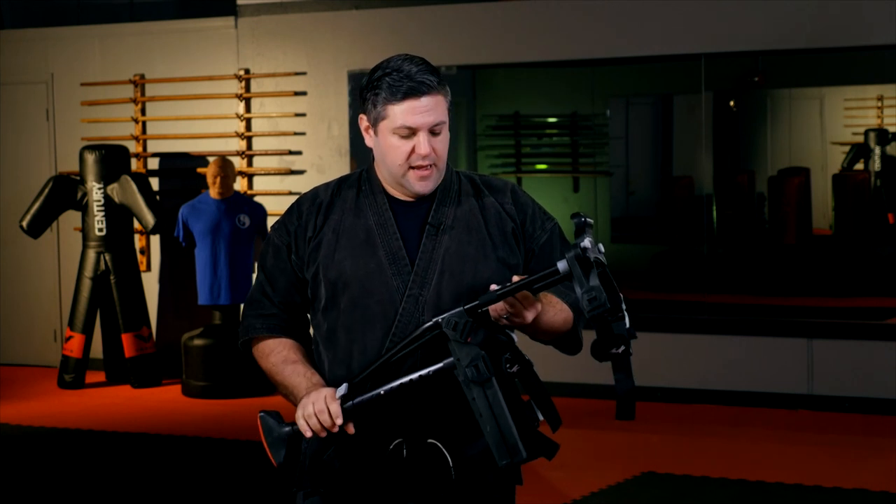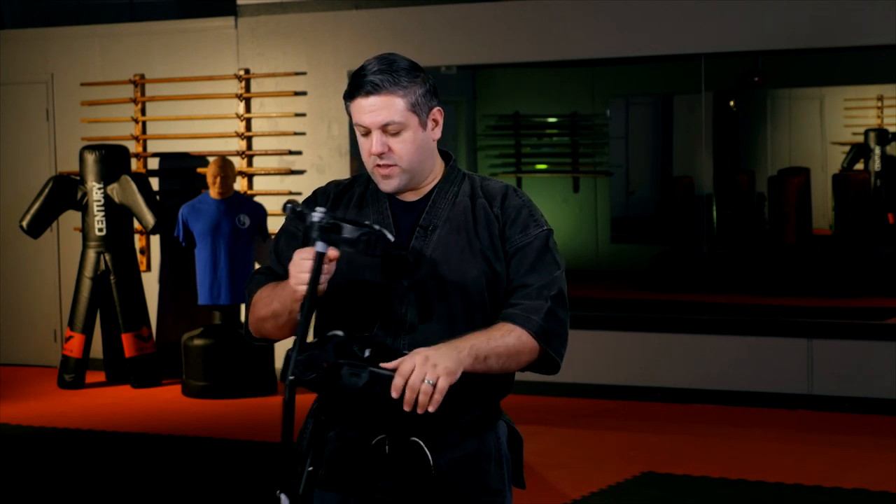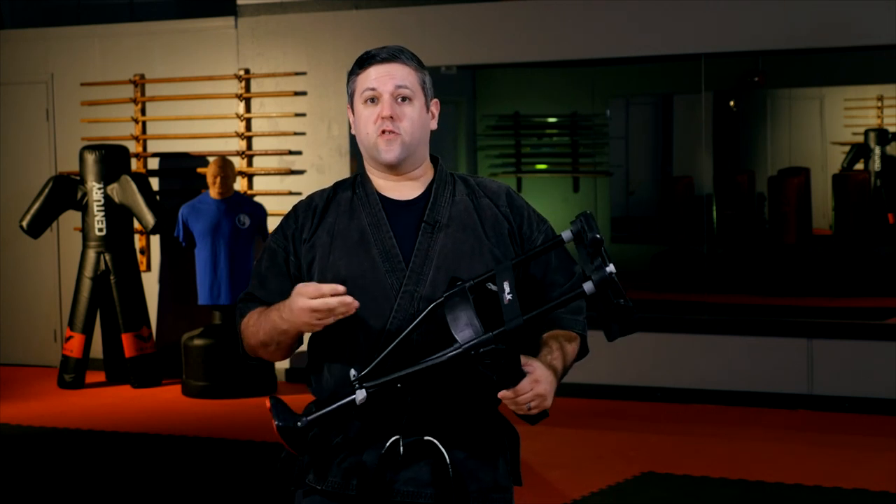Once you have it all together, you need to do a fitting and adjustment. This is a great tool, but if you're off balance with it — if it's not set to the right height — you will shortly start to feel a lot of hip pain in your other leg. They recommend, and they have a whole series of videos on their website as well as in the instructions, how to adjust it for the right height. You want to be at the right level; being too high or too low will be very jarring on your joints.